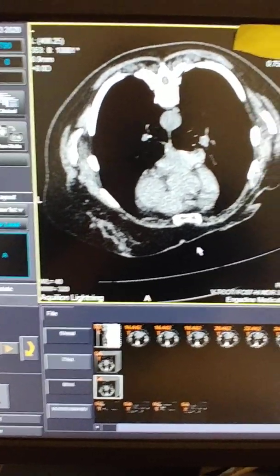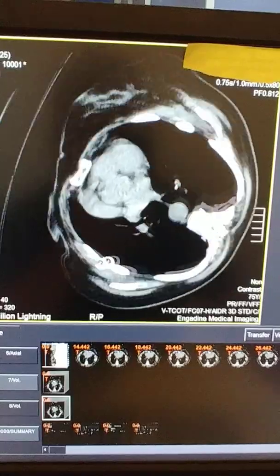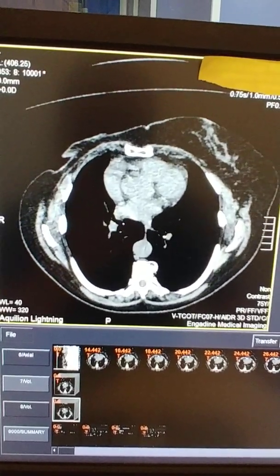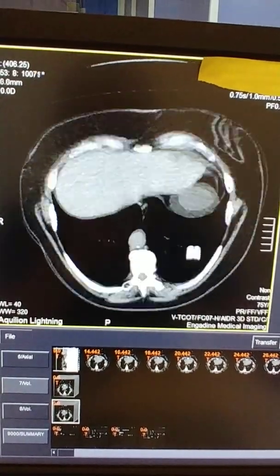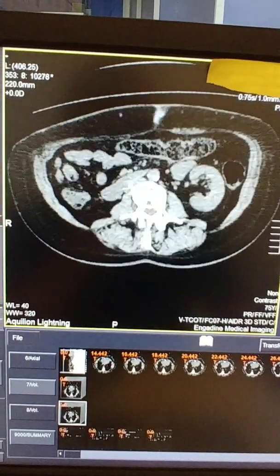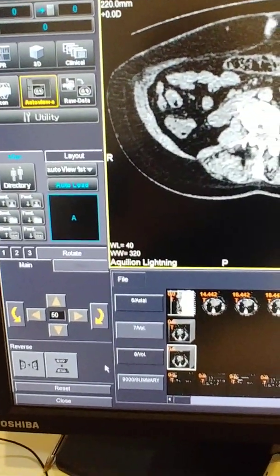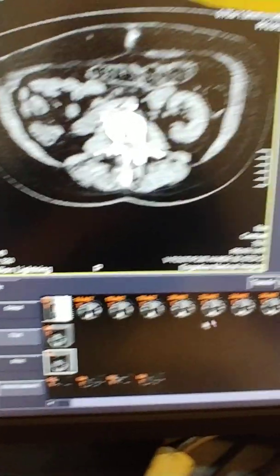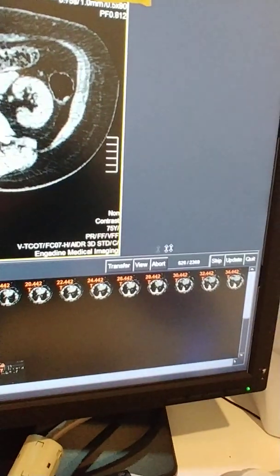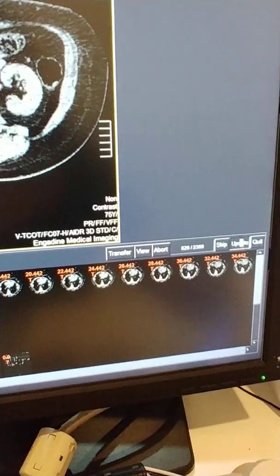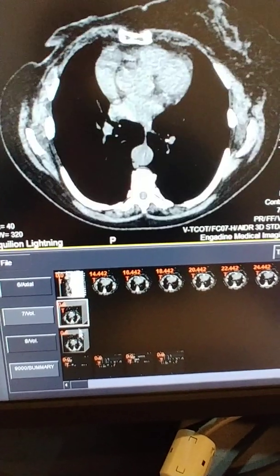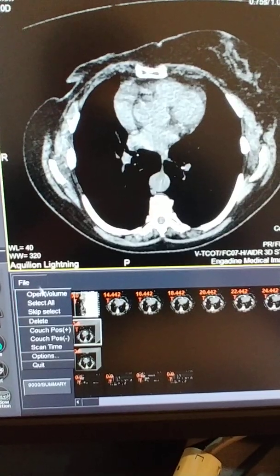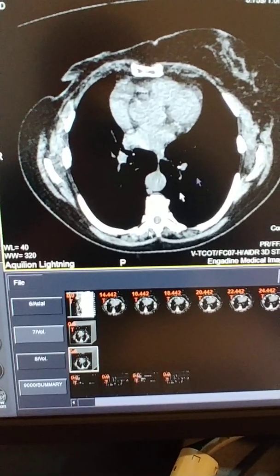We'll click on rotate again and turn this upside down into the supine position as we want it. Then all we need to do is click the reset button, close it, and click the update button.